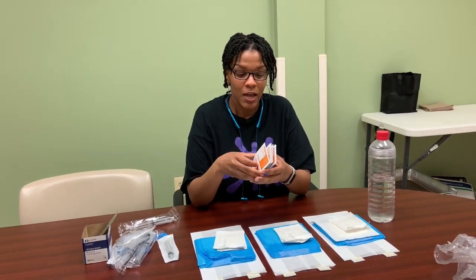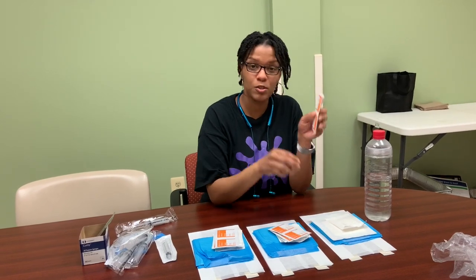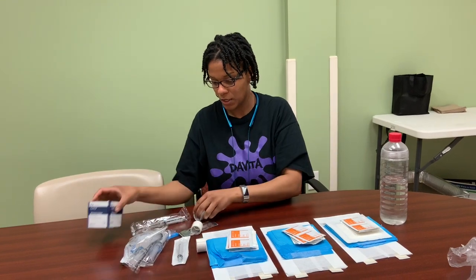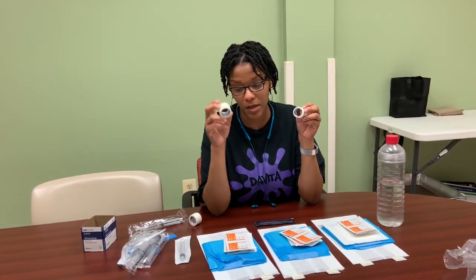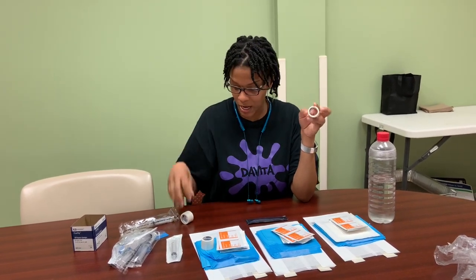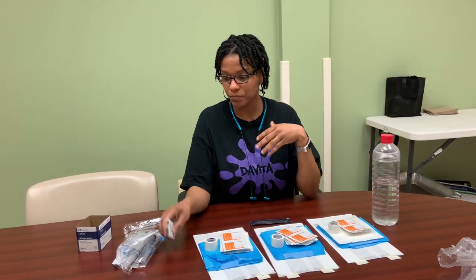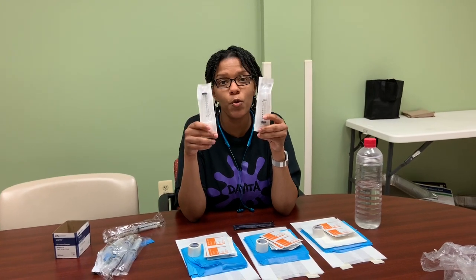Then we have alcohol pads — each patient gets two alcohol pads, sometimes you use more, it just depends on your preference. With our CVCs we have different tape sizes: we use the thicker tape for the needles and then the thinner tape for the CVCs.